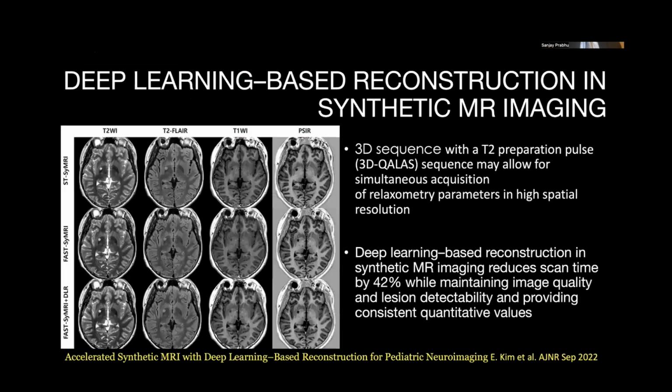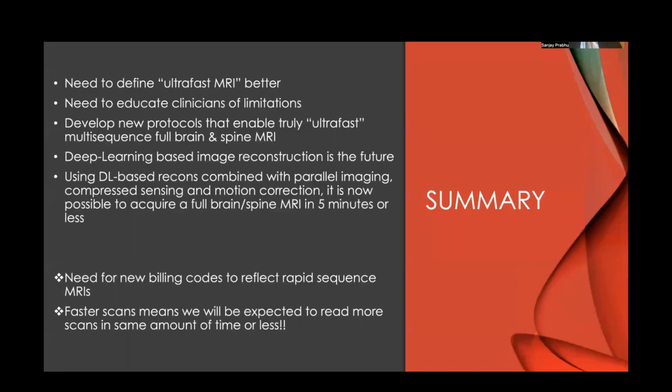However, there's a new innovation in that deep learning-based reconstruction is coming into synthetic MRI, and this can allow us to acquire 3D acquisitions with about 40% reduction in imaging time. And this will be another advantage to get a 3-minute sequence and get multiple contrasts.